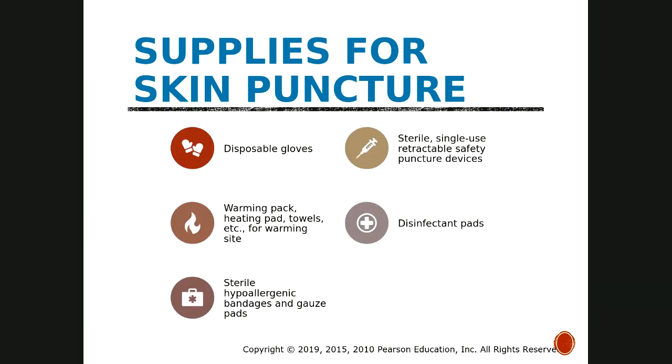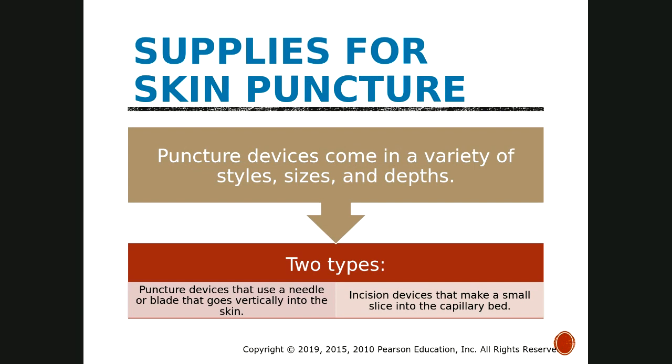Please make note that when we go to draw, if we look at page 379 in your text, figure 11-4, we want to puncture across the grooves, not with the grooves of the finger. And we ideally will use the third and fourth finger of the non-dominant hand.